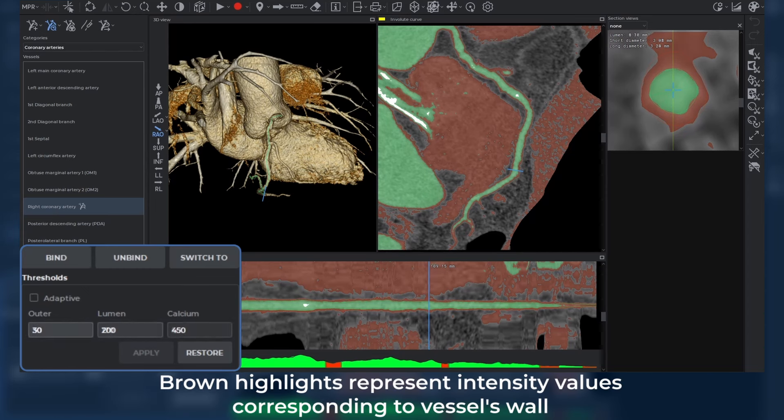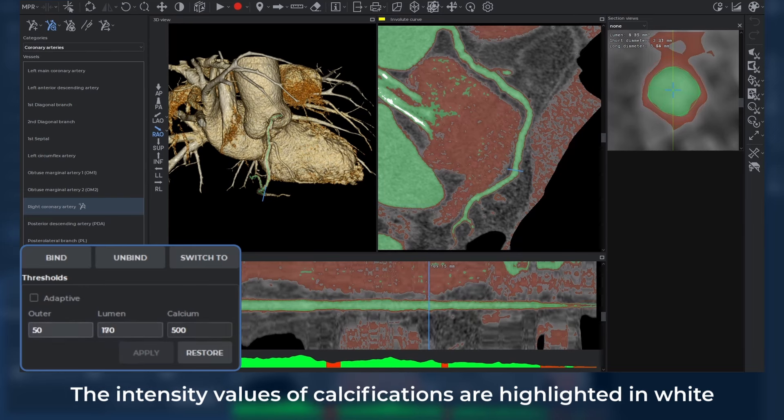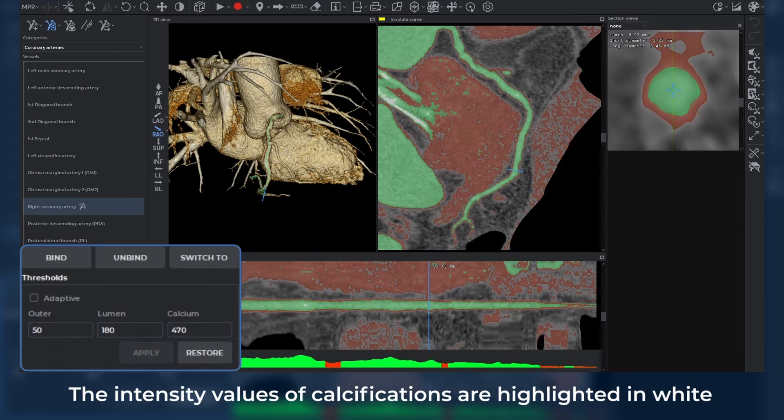Brown highlights represent intensity values corresponding to the vessel's wall. The intensity values of calcifications are highlighted in white.